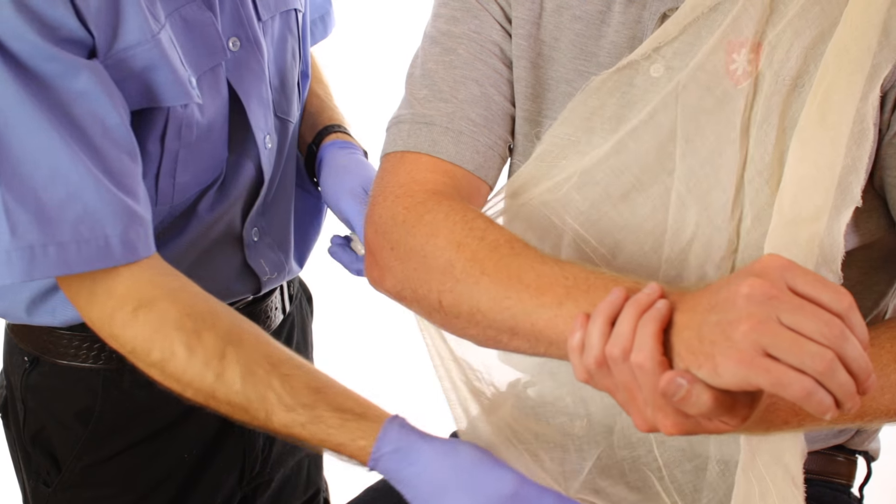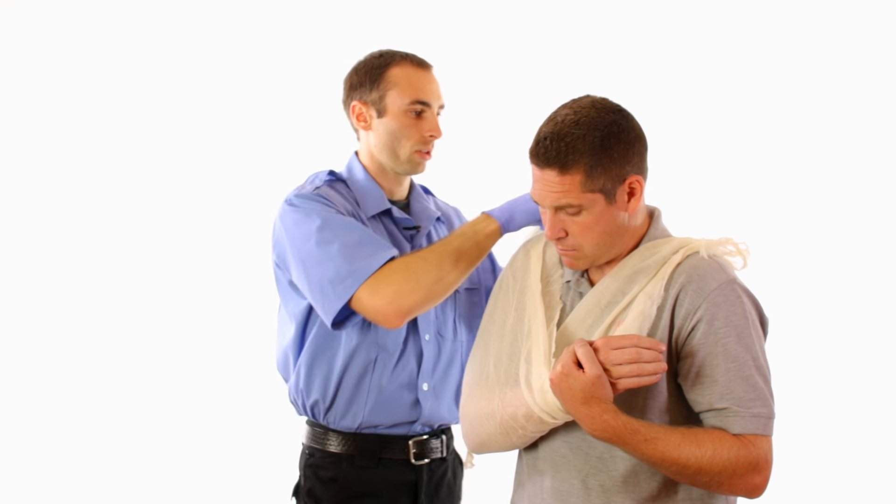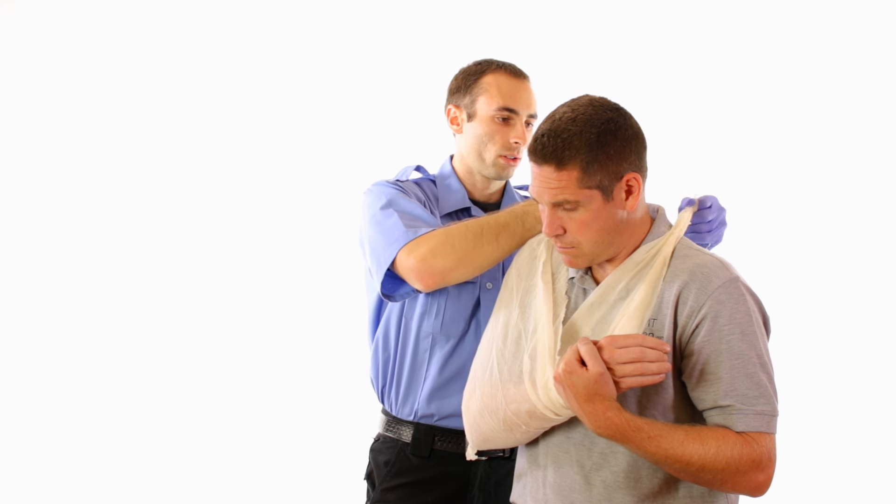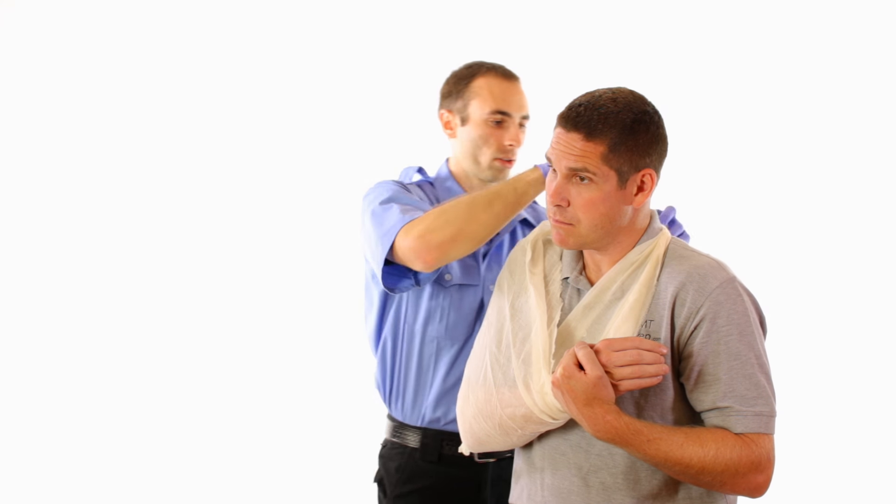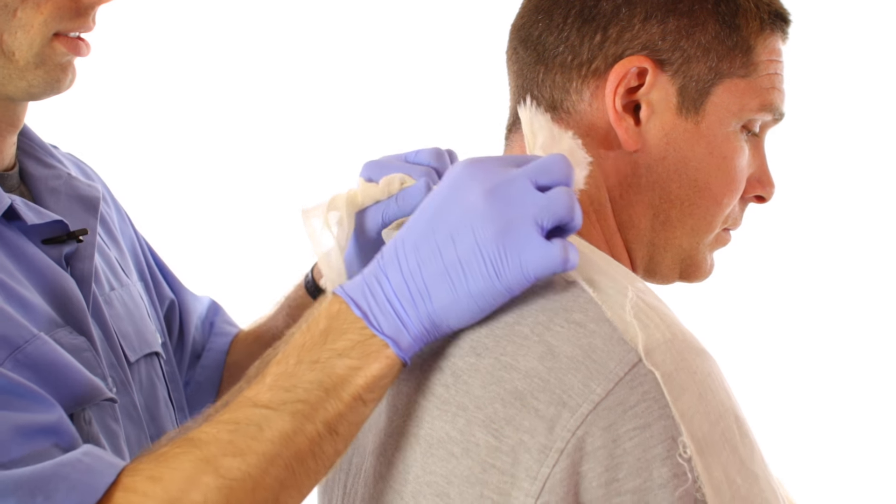Slide the sling behind the extremity and take the remaining bandage up and over the shoulder. Tie the two ends together to adequately support the injured extremity.